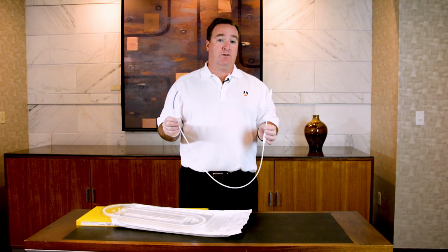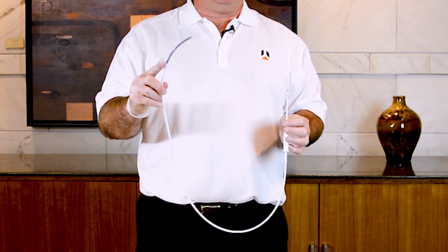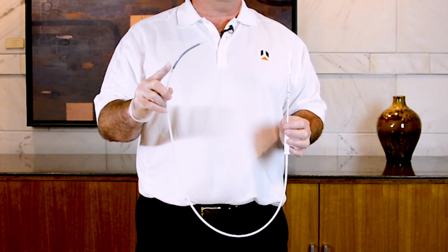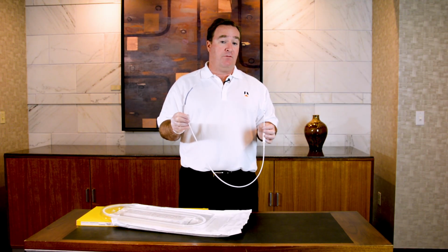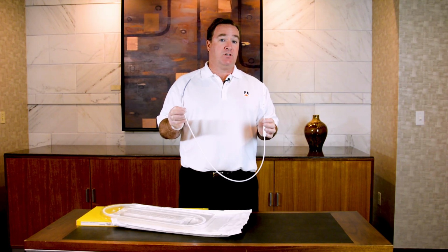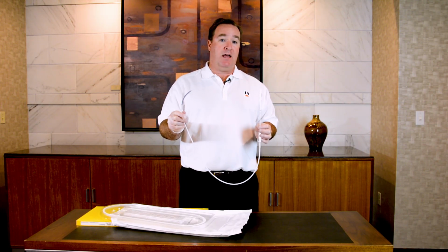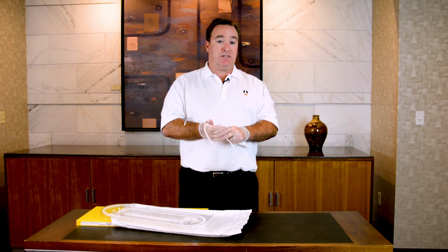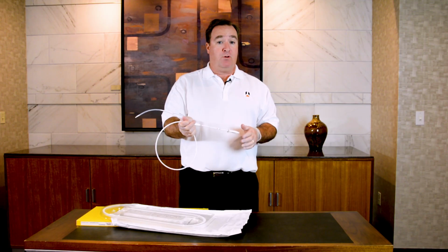So in order to do the side-by-side technique or through the channel technique, it is key to visualize the proximal end of the stent and to keep that in your view during deployment. The Bonastent catheter is a coaxial delivery system, so oftentimes, especially in a tighter stricture, the stent will want to move forward as you're deploying, and you need to make sure to keep the proximal end in position where you want the stent to land.